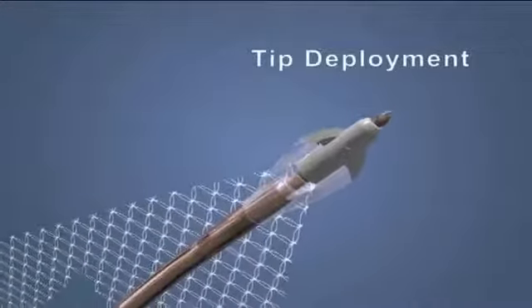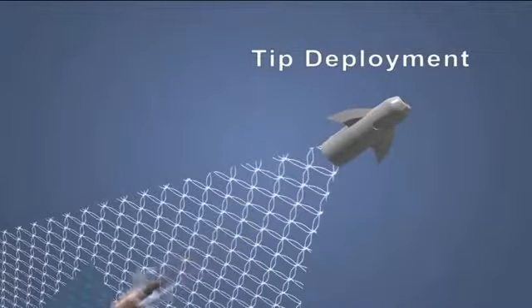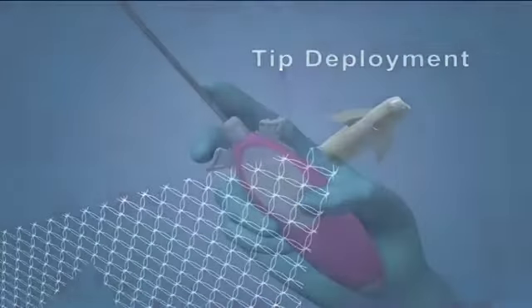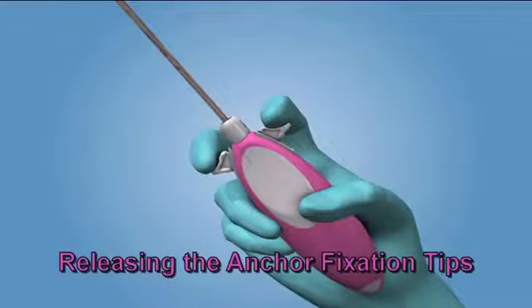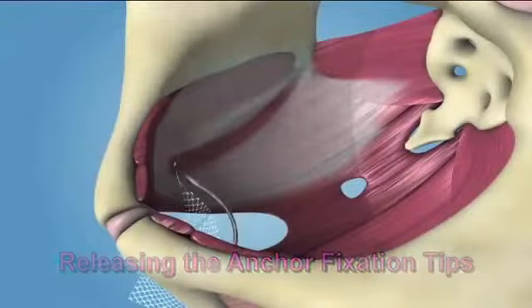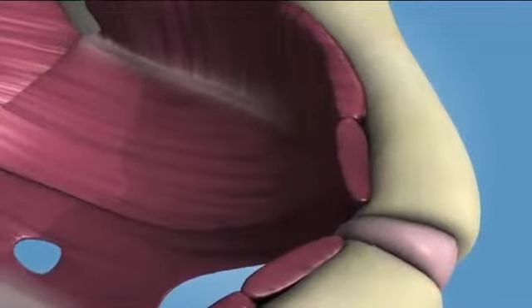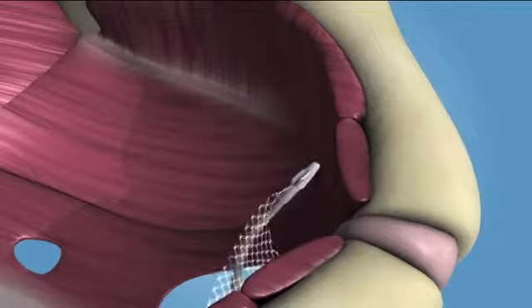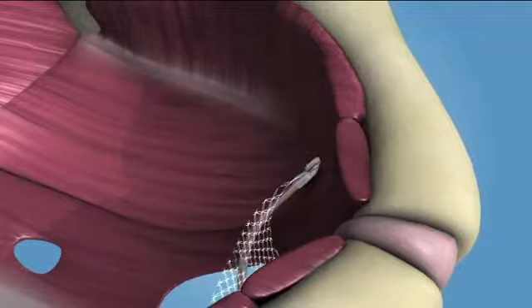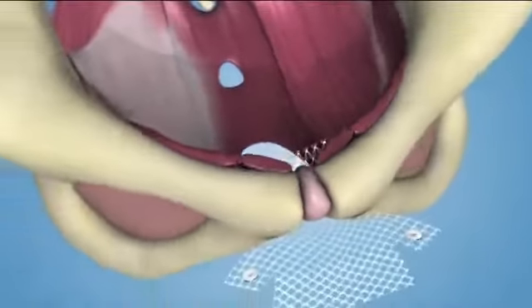Advance the needle until the blue midline marker on the mesh is aligned with the vaginal incision. Once the graft is in position, release the fixation tip by pulling back on the sliders with 2 fingers of the contralateral hand. Keep the slider depressed while removing the needle. Perform this technique for both patients' right and left sides. Affix center of the graft to the bladder neck with sutures.